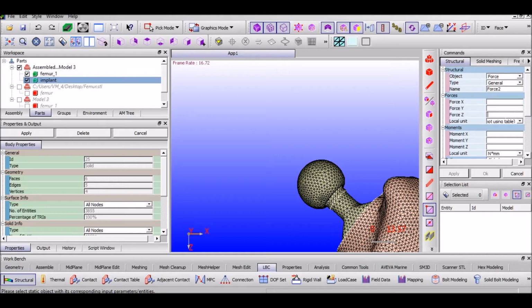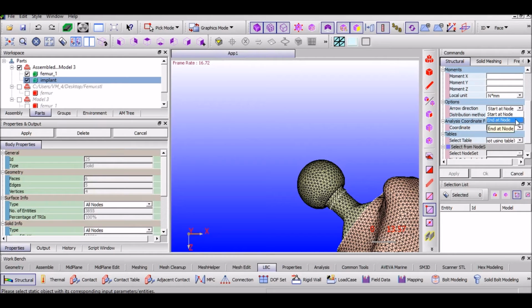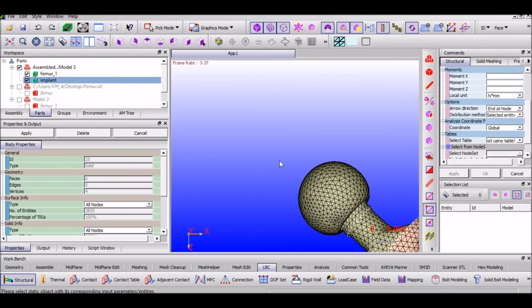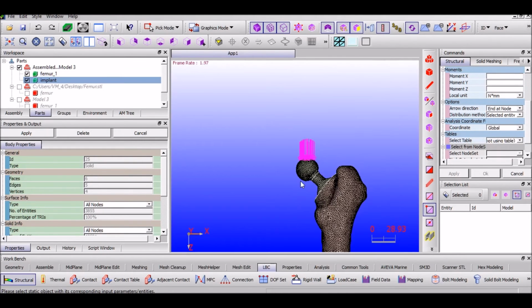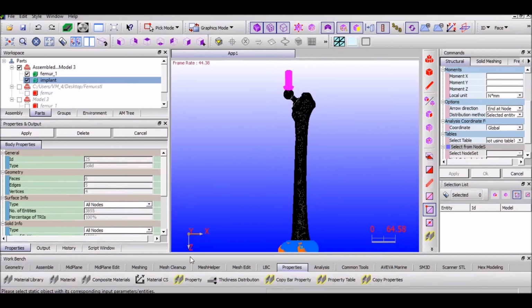Next, we need to apply a vertical force at the head of the implant. Therefore, select force, change the magnitude of the force. Under Z direction, select the top nodes of the femoral implant and click apply. And hence a vertical force has been applied. The next step is to assign properties to both the bone and the metal implant.